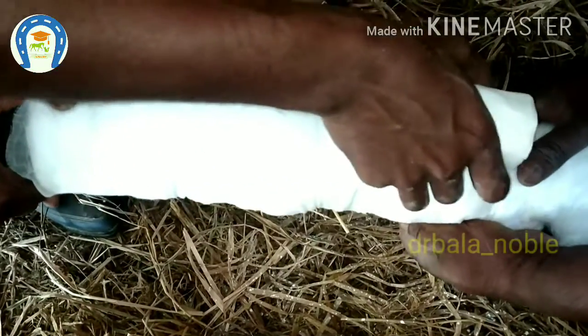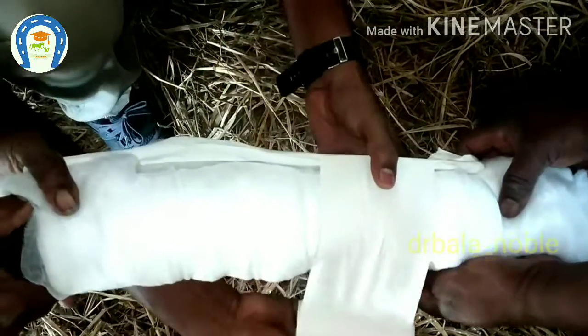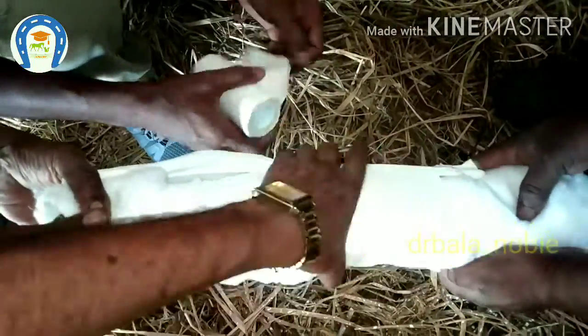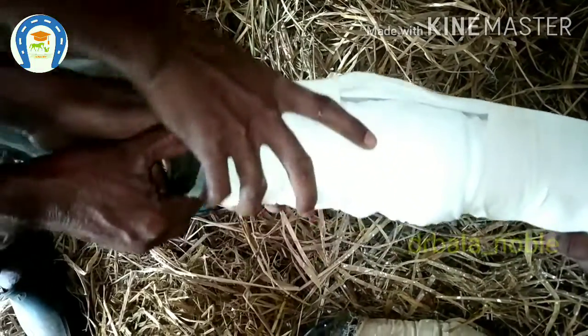Now apply the adhesive plaster above and below the bent area. Start at the splint so you will have grip to tighten it. You have to tighten the plaster in a way that it is not very loose and not very tight — in both cases it is dangerous.